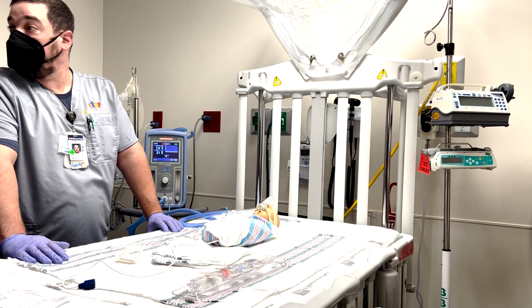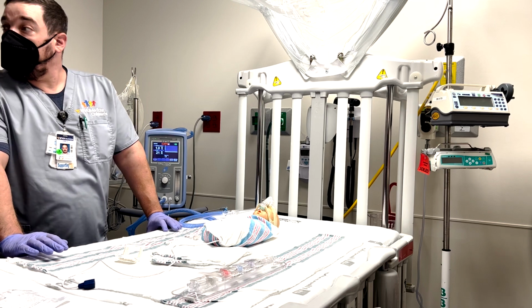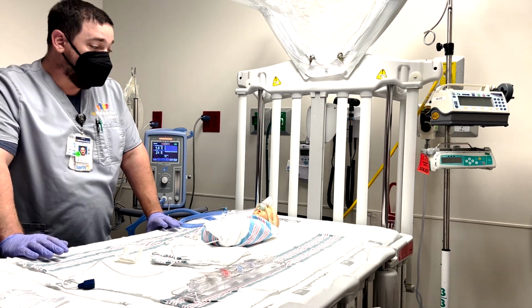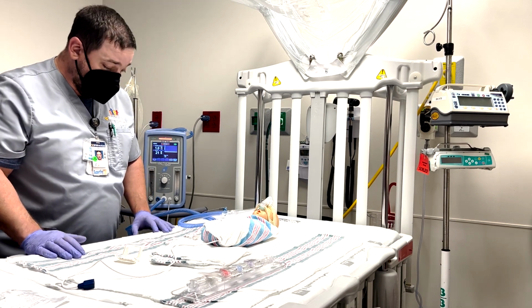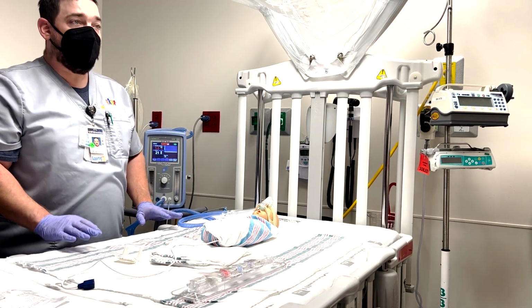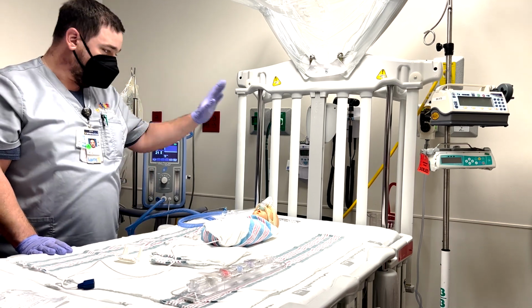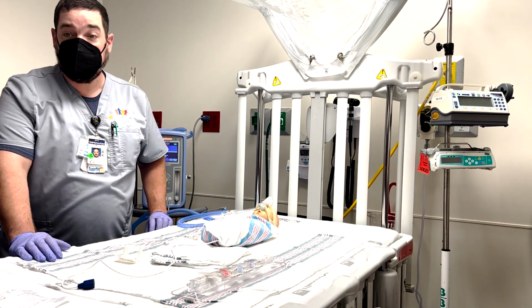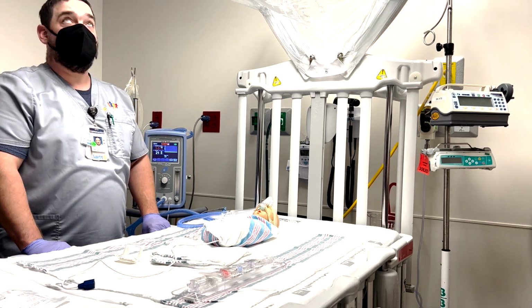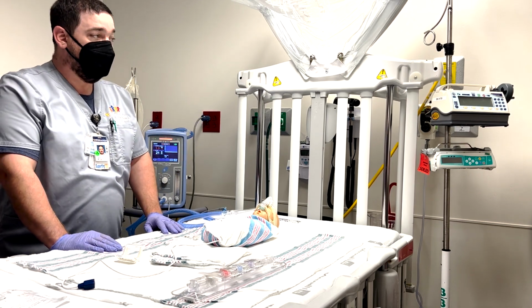Jim, could you talk about how fast we're going to see improvement, how long you get between weans, and then the upper limit? Okay. So the hard part about this, and this is what we discussed earlier, is I can't give you hard and fast numbers to say that this is this, that's that. If I've got a baby chilling on a nasal CPAP of 6 and 28%, and they're happy as a lark, that's okay.